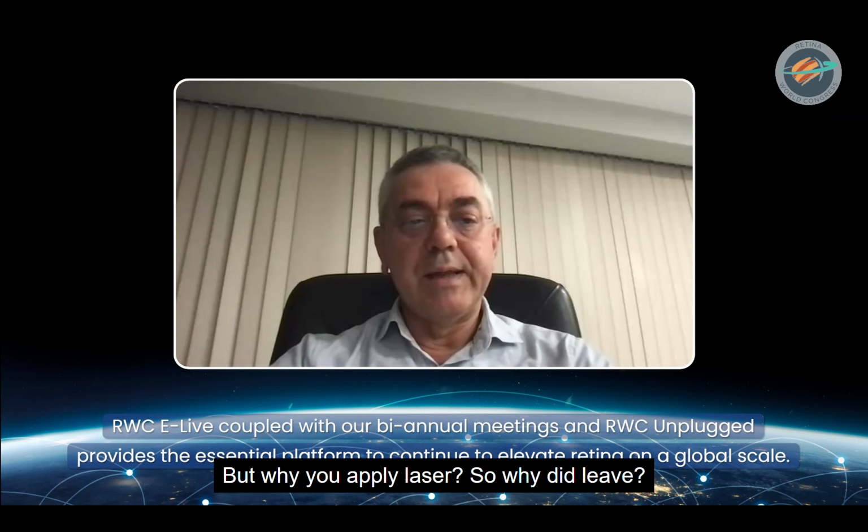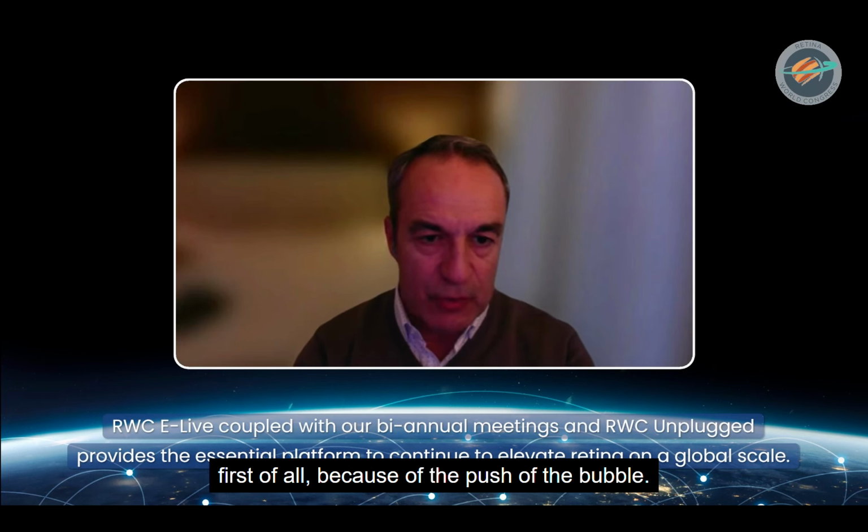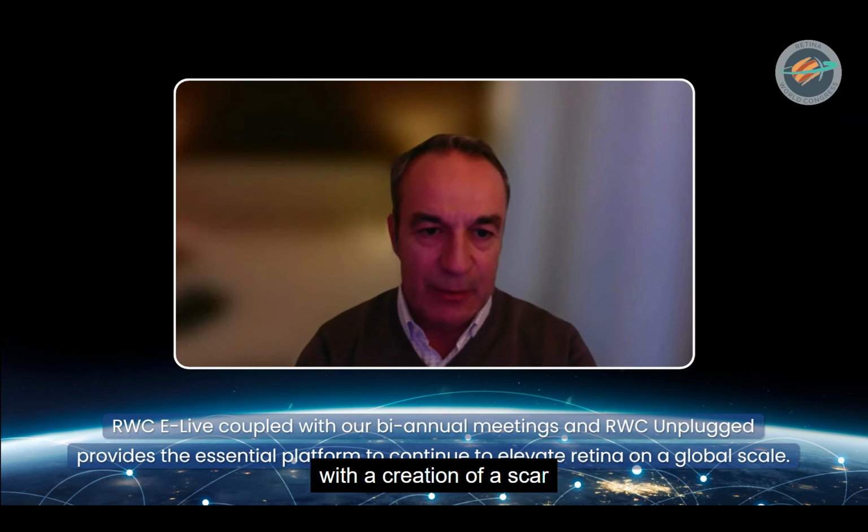But why did you apply laser? I didn't want to extend the break, first of all, because of the push of the bubble. And secondly, I wanted some kind of adhesion, steadily, with the creation of a scar in an area which is not important to the vision. That's why I applied laser.